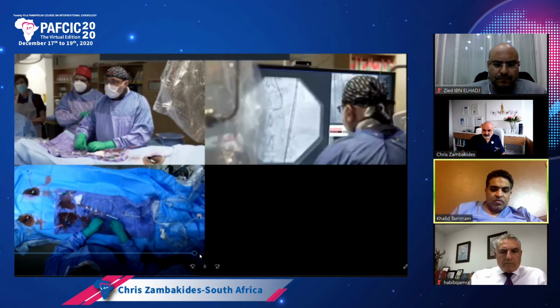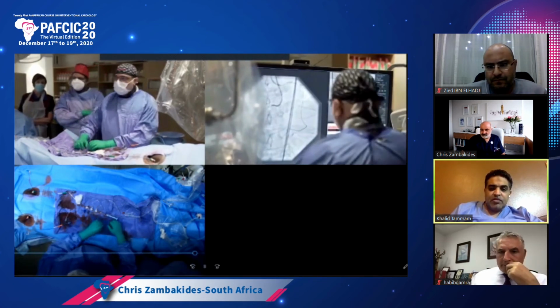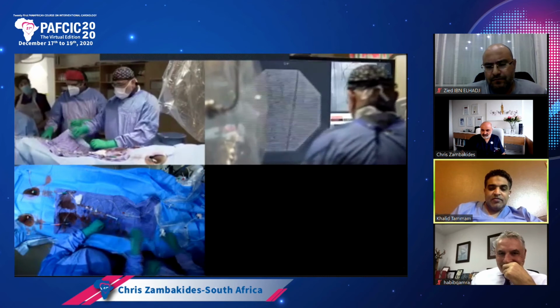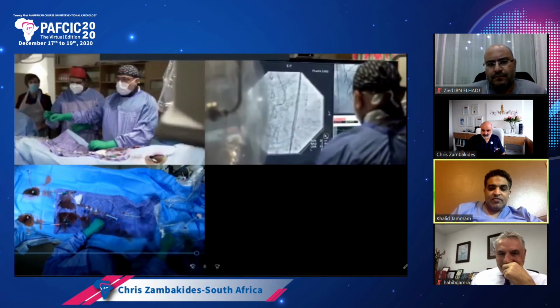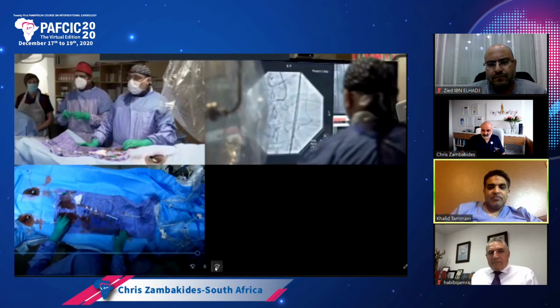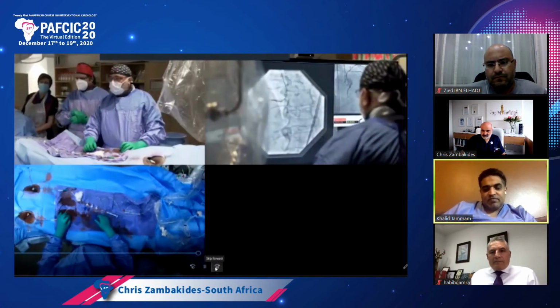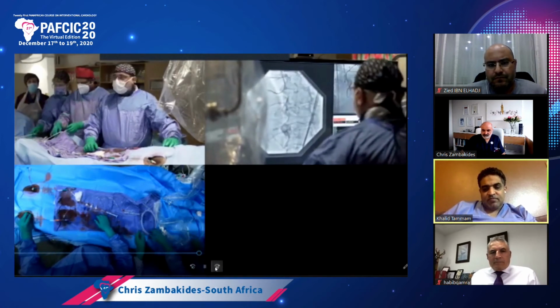You want the antegrade injection? Can you move the video a little bit? Maybe we can see the angio. Too far back. Okay, go back in. Give me the Sion Black again. Let me just try and get again into the stent. So when I pulled back, it came back a bit too much, but I didn't want to cause any damage, so it's safer.